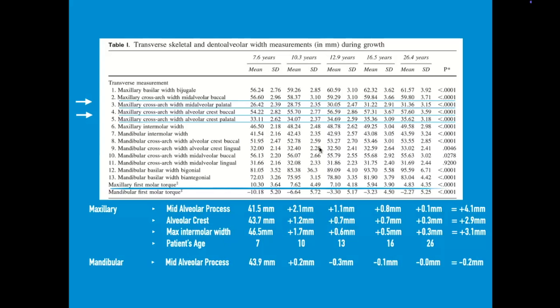So overall, about 60% skeletal in kids this age, sometimes a little bit better than that, sometimes a little bit worse, depending on the design of the expander, depending on how fast you turn it. In general, shoot for the best anchorage possible and err toward faster turning over slower turning. And when I say faster, I never mean more than like 1 turn per day, okay? Just to be clear, because 4 to 6 turns per day, all that's happened in the past and has been proven to be unnecessary. But when I say faster, I mean more toward 1 turn per day versus like a turn per week or something like that. If you follow those rules, you should get the most skeletal expansion possible for the patient that you have.